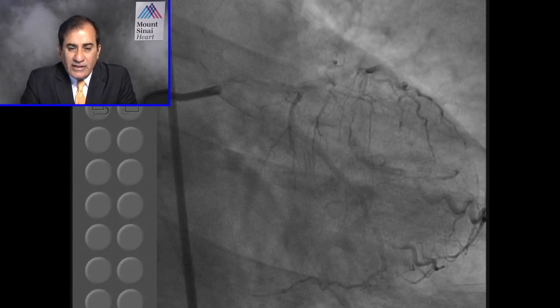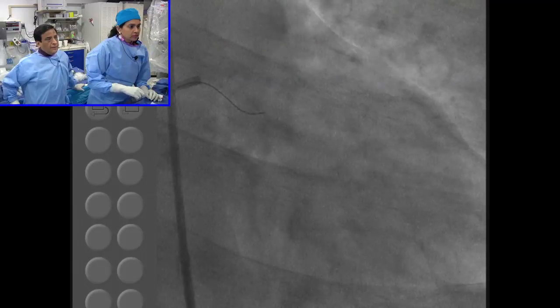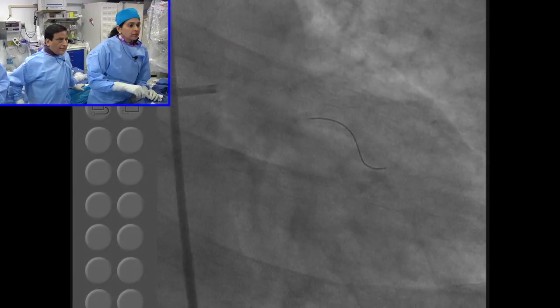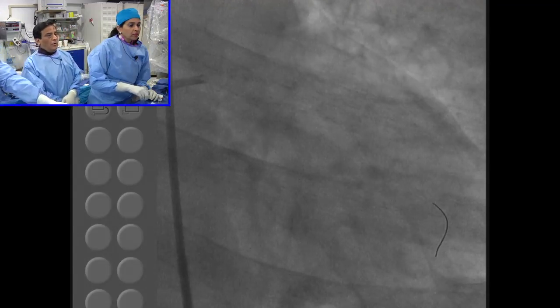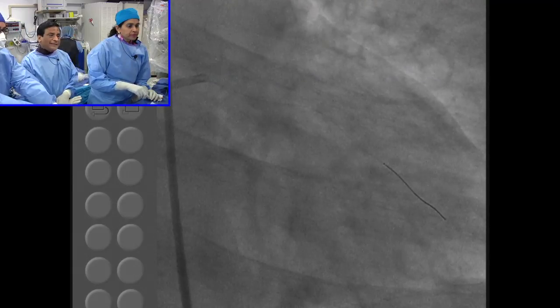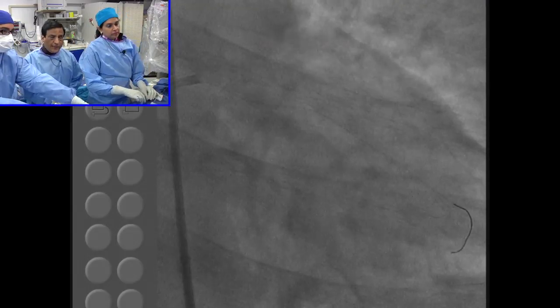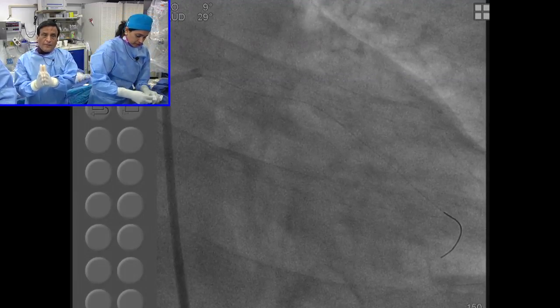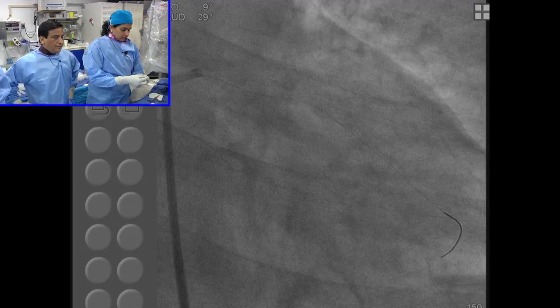I'm sure you've conducted a more detailed breakdown of your own bifurcation series. What percentage of your cases are the DK crush now? Yeah, well, actually, DK crush we still use very little. Yeah, that's what I thought. Ours is more SKS, no? Yeah, so SKS, or whether we use a T stent or kind of mini crush and so forth. So that's more our working strategy in the majority of our patients. So that makes still about 25%, same thing, 25-30%. Same thing in that expert center of the 3600, the complex group was about 1100, so just close to one third or 30%.